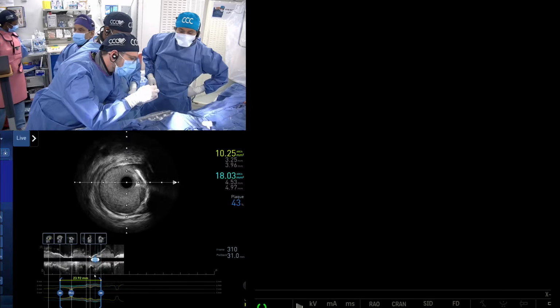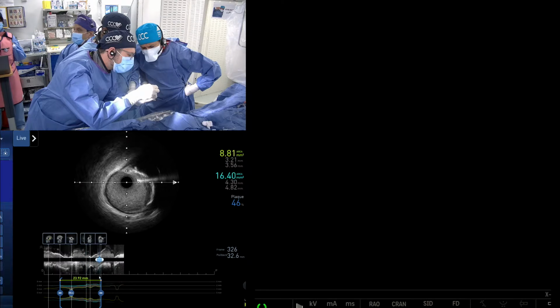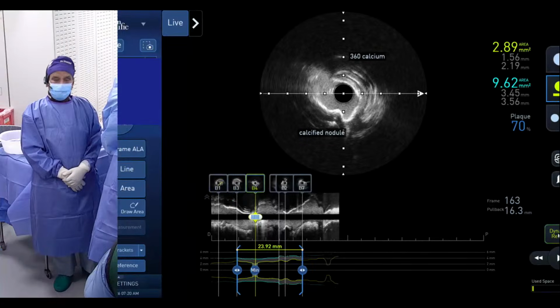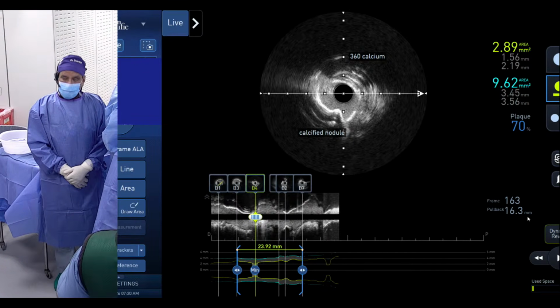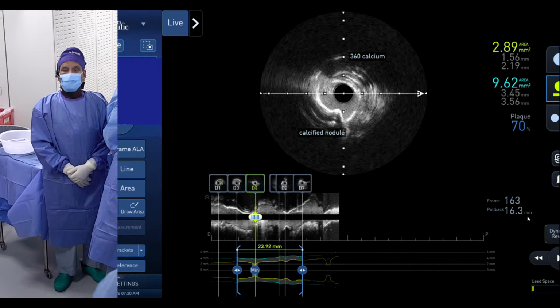Now the only advantage is that both IVL and drug coated balloon are appropriately reimbursed. And the same thing happened with MCS. You have an IABP, there is no extra DRG on that. But you have an MCS device using Impella, which costs about 25,000, but the DRG goes up significantly, close to $100,000.